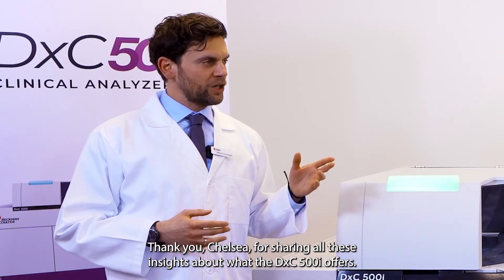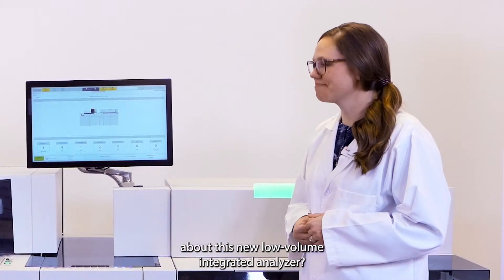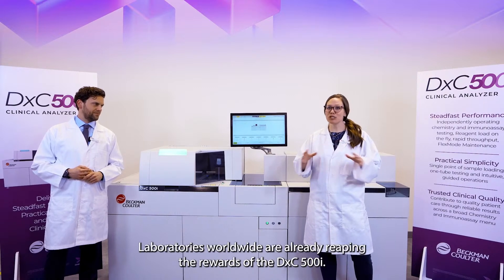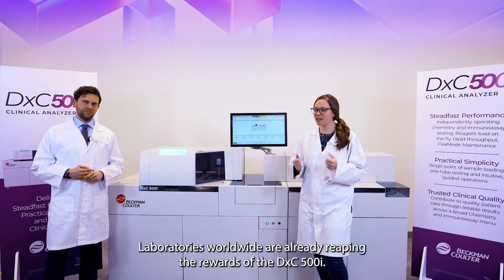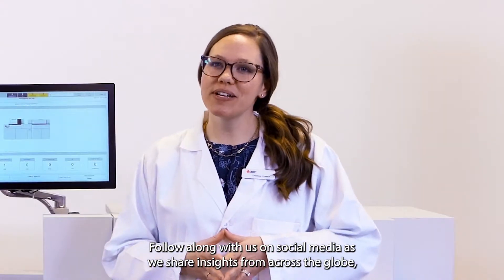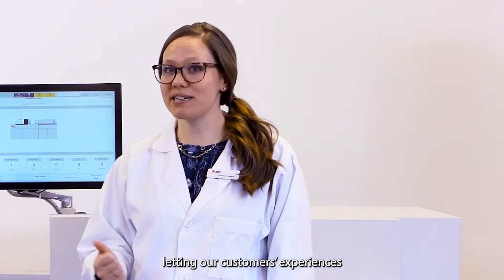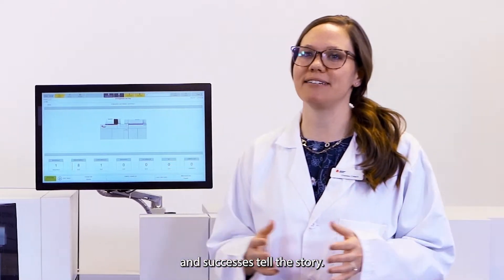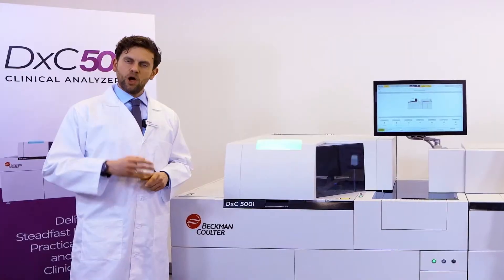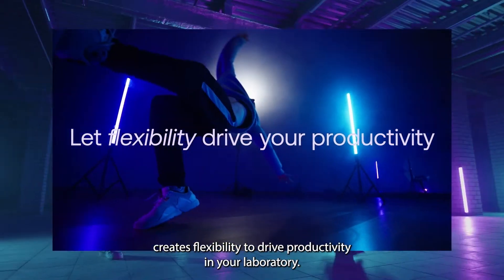Thank you, Chelsea, for sharing all these insights about what the DXC 500i offers. How can our customers learn more about this new low-volume integrated analyzer? Witness the impact firsthand — laboratories worldwide are already reaping the rewards of the DXC 500i. This entire week will be dedicated to the DXC 500i. Follow along with us on social media as we share insights from across the globe, letting our customers' experiences and successes tell the story. Thank you to our audience for being part of today's debut of the DXC 500i Clinical Analyzer.